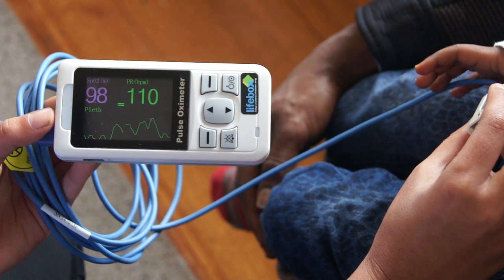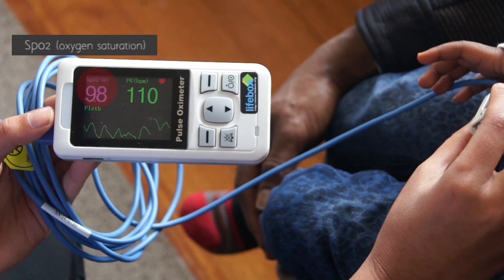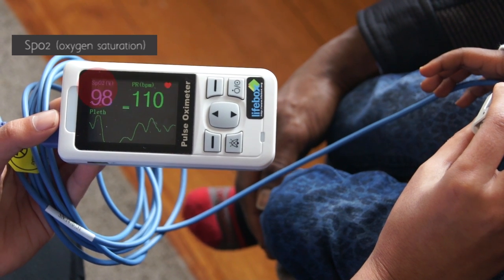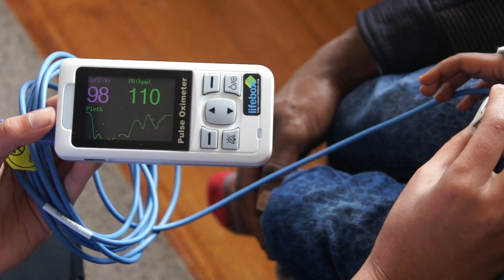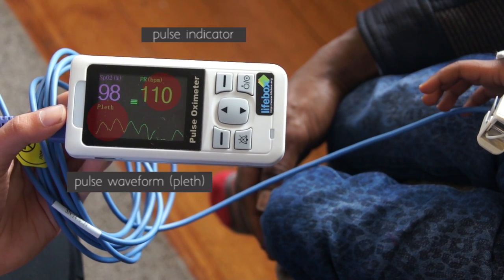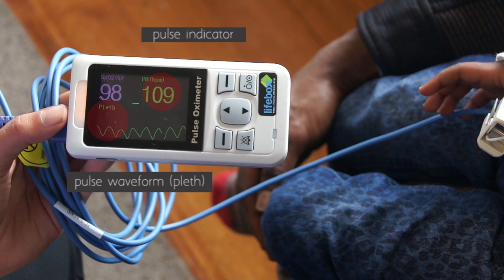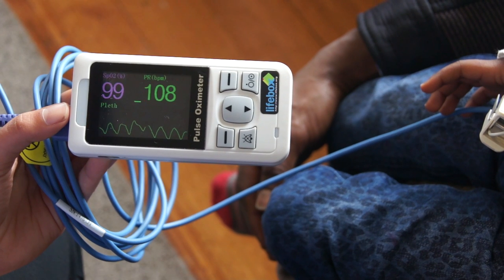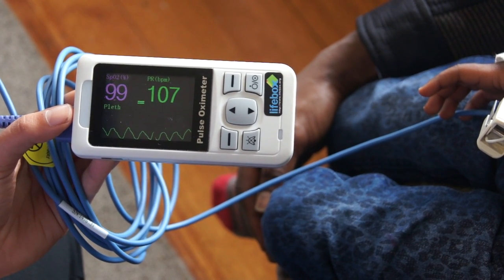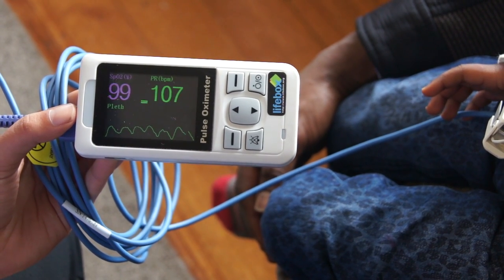The pulse oximeter will tell you the blood oxygen level, technically called the peripheral capillary oxygen saturation, also called the oxygen saturation, SpO2, or SATs for short. The pulse oximeter will also tell you the heart rate and display a pulse indicator or waveform. It is important to check for a regular pulse indicator or waveform to ensure an accurate reading. The oximeter gives an audible beep to indicate each heartbeat, and the beep will change tone according to lower or higher saturations.